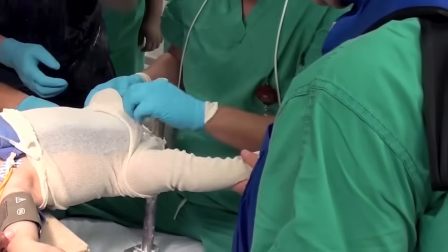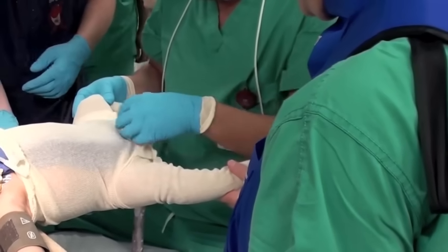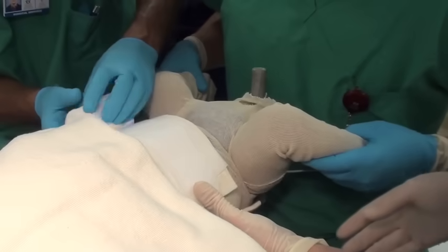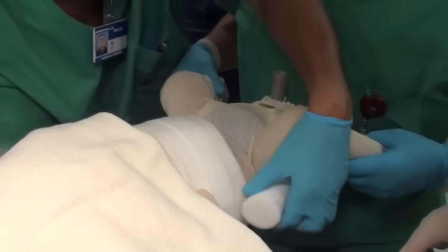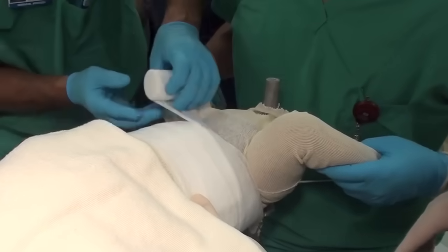The baby is positioned on this cast box, and the surgeon holds the legs in the reduced position. The hips are held very carefully, and then some padding is wrapped around the baby. This is a cotton or synthetic padding that provides some soft padding inside.